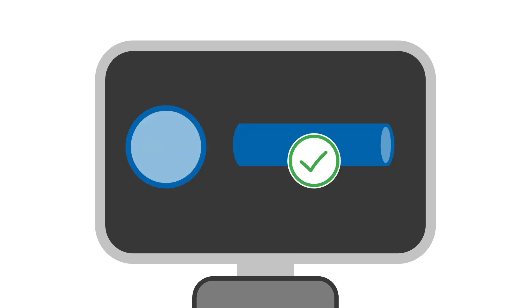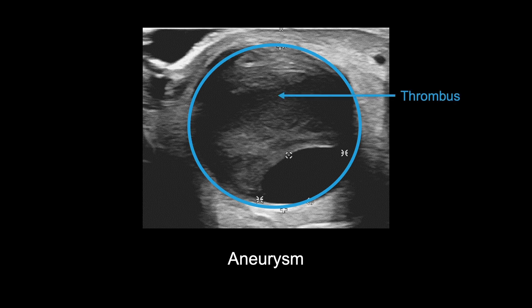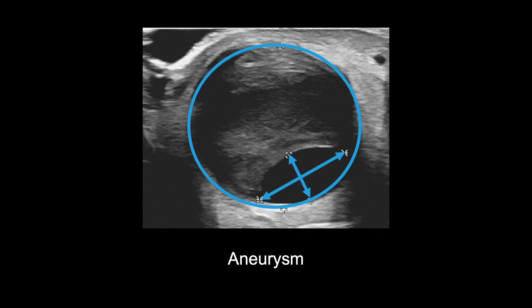On ultrasound, aneurysms are measured in transverse and then confirmed in longitudinal view. They will usually appear circular in transverse view, as seen with the aneurysm in this image. Any thrombus within the aneurysm, such as the one shown here, should be noted as it can expand to block fistula flow. Thrombus also increases the risk of aneurysm rupture. Measure the diameter of the aneurysm vertically; it can also be useful to measure the length and width of the patent part of the vessel, meaning the area not blocked by thrombus.